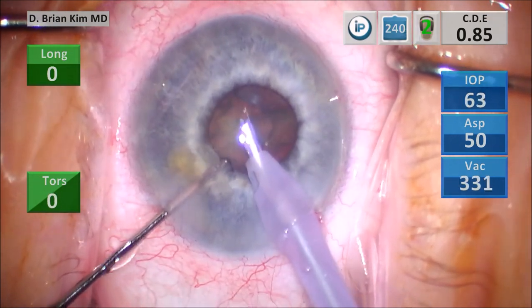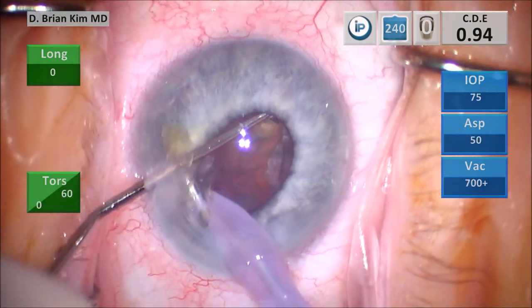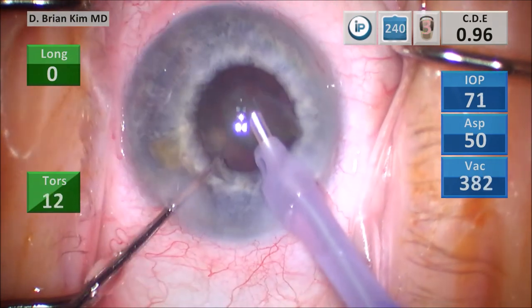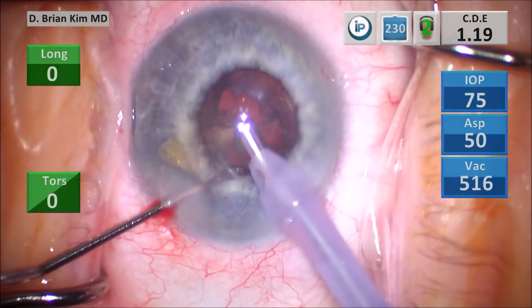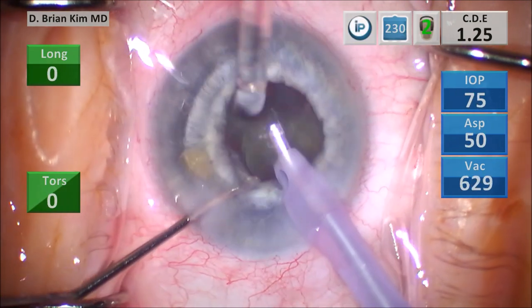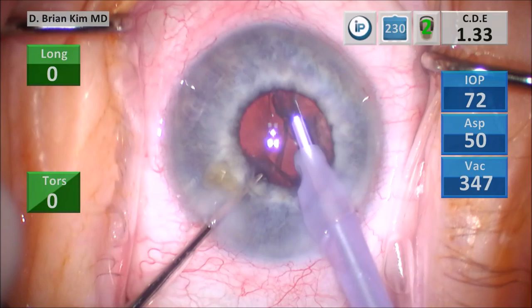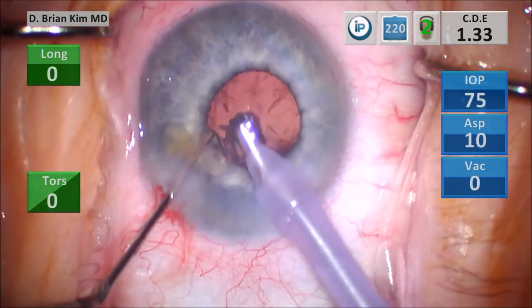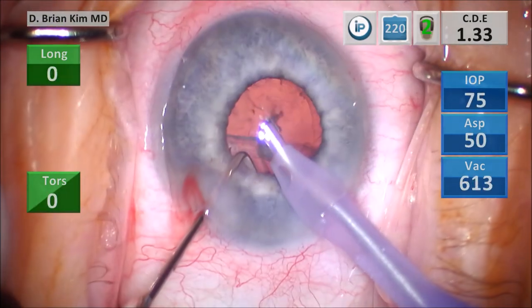Use the chopper to hold the iris back — now that third quadrant has been emulsified. I'm placing the chopper out to the equator again, crushing that fourth quadrant. Again I'm using the chopper to hold that iris back, and then very gently in the central safe zone I'm using high vacuum to emulsify the lens piece. You have to keep that phaco tip in the central safe zone — you don't want to deviate out of it. This is a very small central safe zone in a small pupil with floppy iris. I'm then using vacuum to prolapse the epinucleus out of the bag, making sure the tip is nowhere near the iris, with my chopper keeping that sub-incisional iris out of the way.